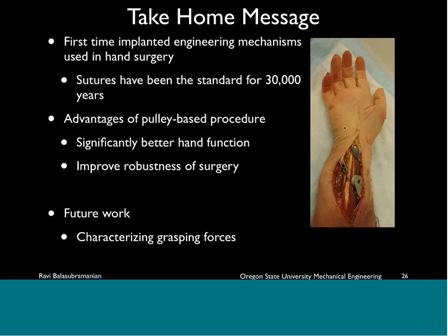And I want to highlight here that what we're doing here is really fundamental. Sutures have been the standard in surgery for 30,000 years, and I repeat, it's 30,000 years. There's no typo here. And what we're trying to do is replace the suture with engineering mechanisms to lead to better hand function in some cases. Okay, so that's the first take-home message.